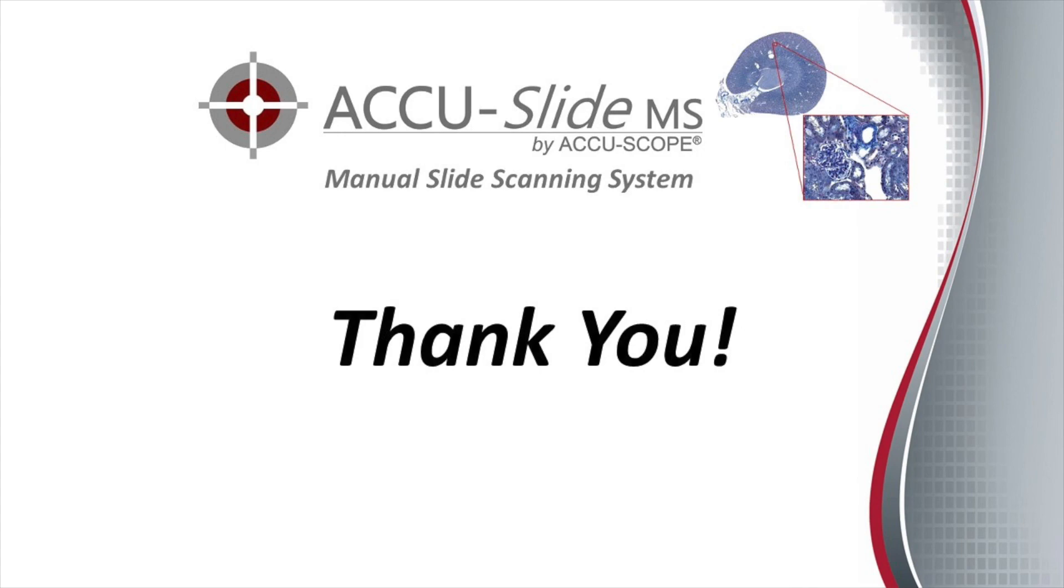AccuSlide MS. Before using AccuSlide MS for the first time, please watch the tutorials on camera and scan settings and scanning a slide.